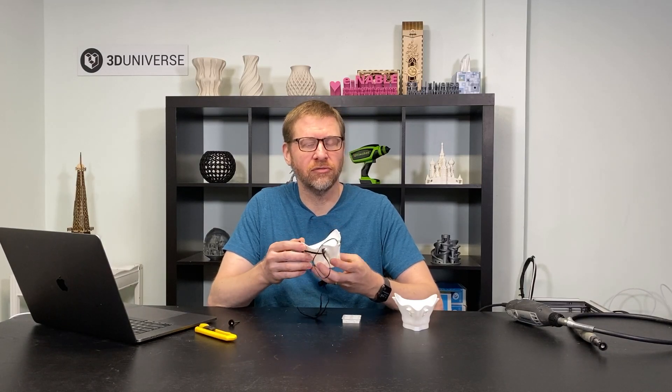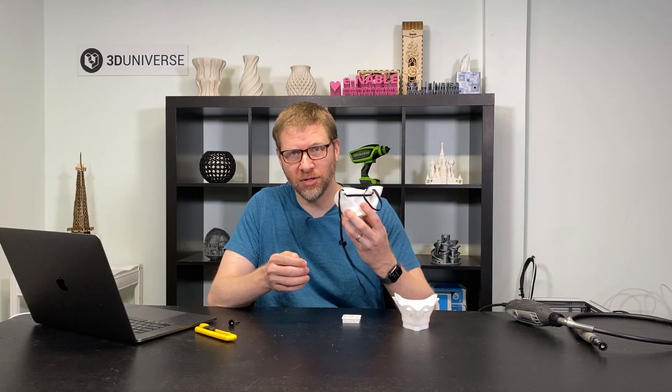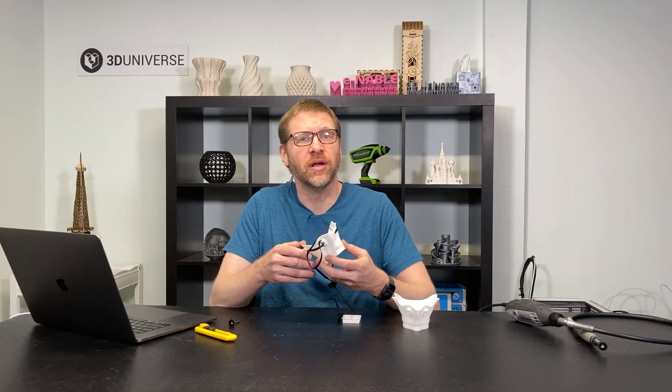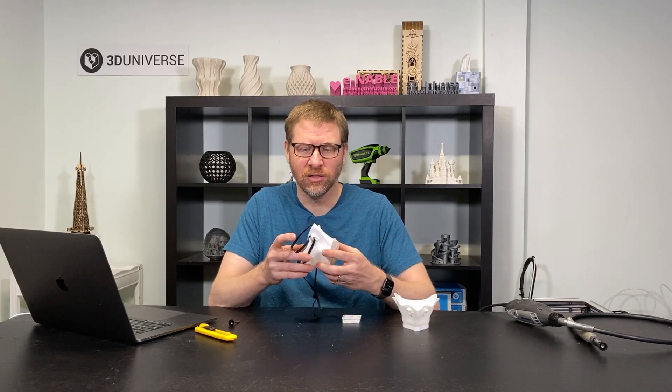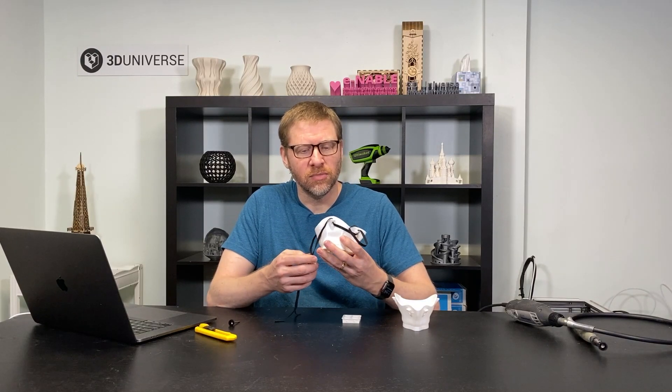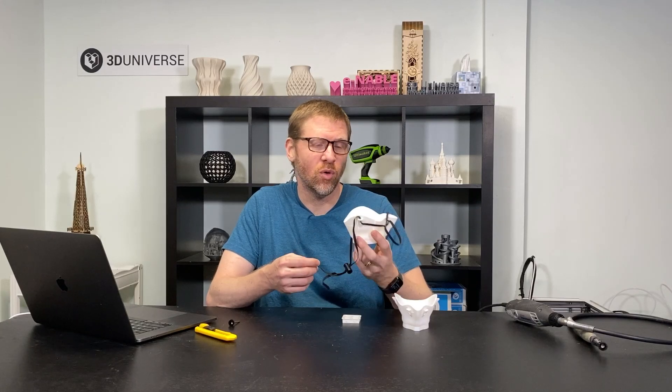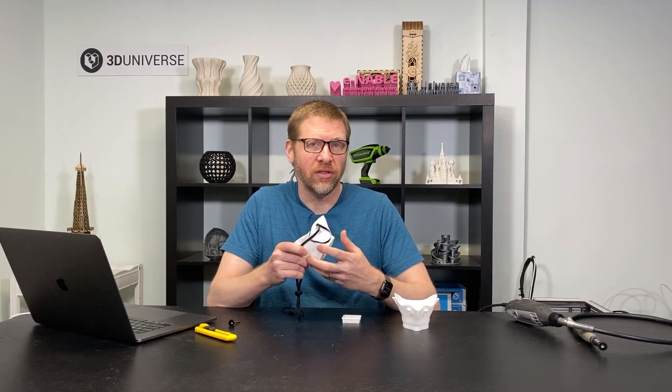This video is going to be specifically for those that have a 3D printer and want to make this mask, either for yourself and your family or for donation to help us get these masks into the hands of those that need them. There are some unique aspects to making sure that you get the right kind of result and the right kind of quality, so we're going to take you through that in this video.